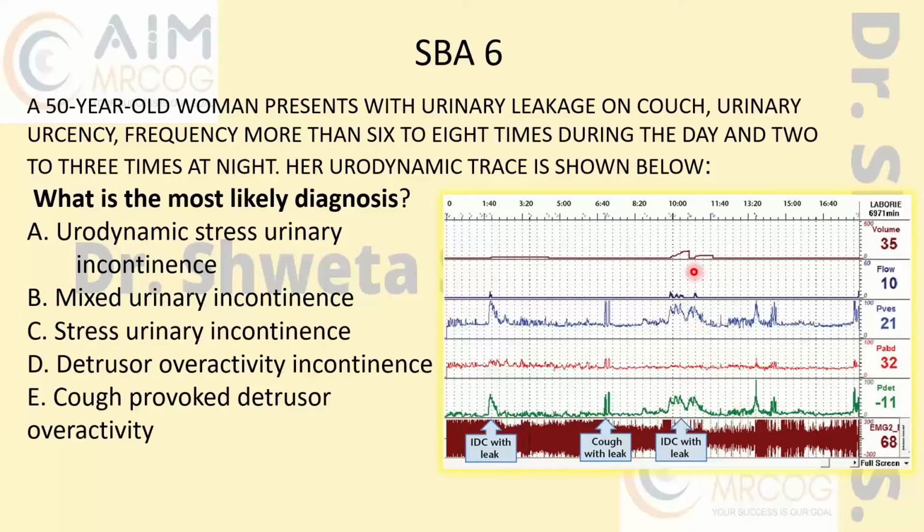Here, the detrusor has contracted. I will just show you here. See, here it is still significant, but here, see how small the amount of leak is. So this small rise in the flow, in the volume also, is significant. So never miss this small finding. So what is your diagnosis, Dr. Gopa? This looks like detrusor overactivity with leak. Okay. So this is detrusor overactivity with the leak.